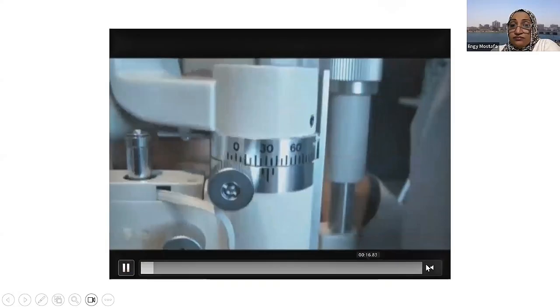So this is the slit lamp, and this is the halo, and you have to look at the cornea across the whole cornea, not just here. Here's another one about how to decouple the light system to fall directly on the limbus, and you examine the cornea by itself. And here's how it's falling on the limbus and going through the halo.